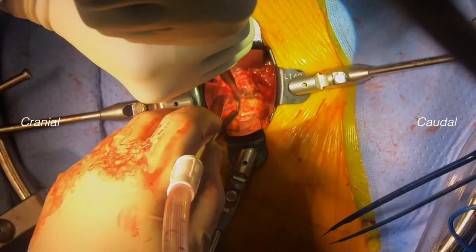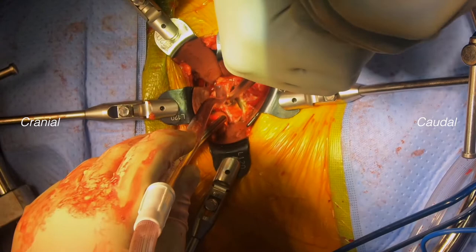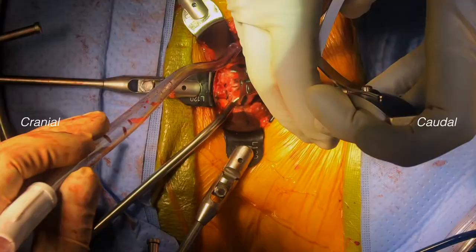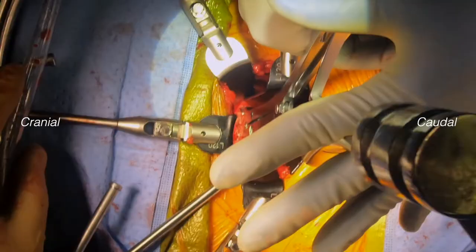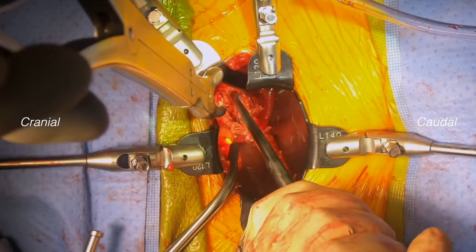Prior to disc removal, we use an end plate dissector to free up the disc and cartilage end plate and the bony end plate above and below. We then use a disc grasper to remove the entire disc. Small remaining fragments are removed with straight and angled curettes and a pituitary rongeur.